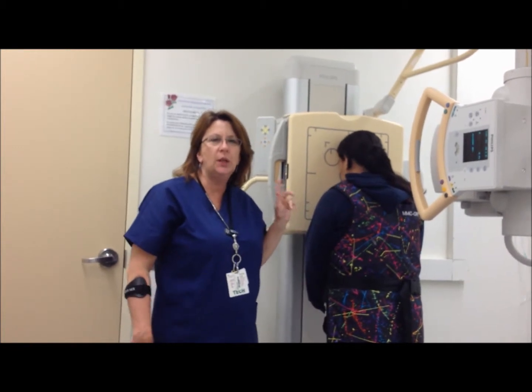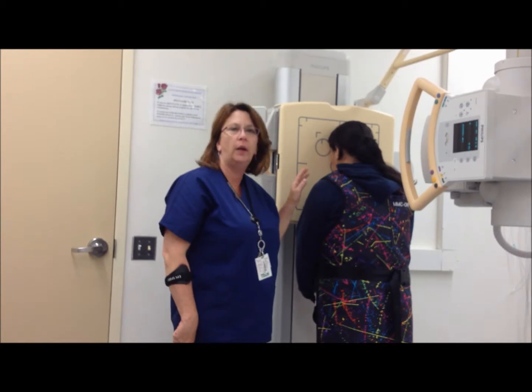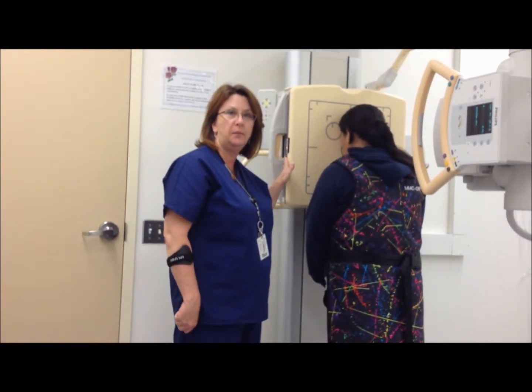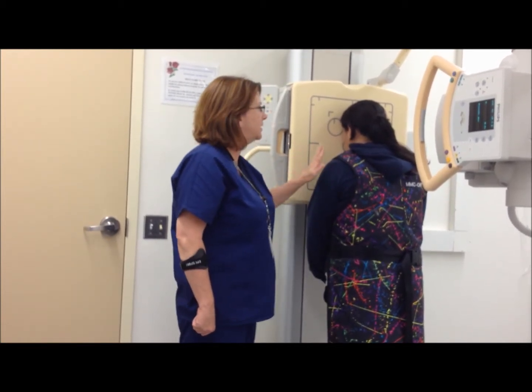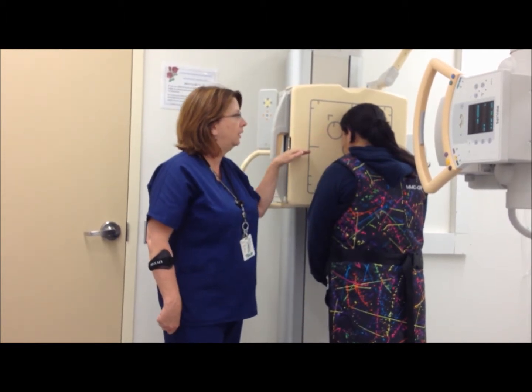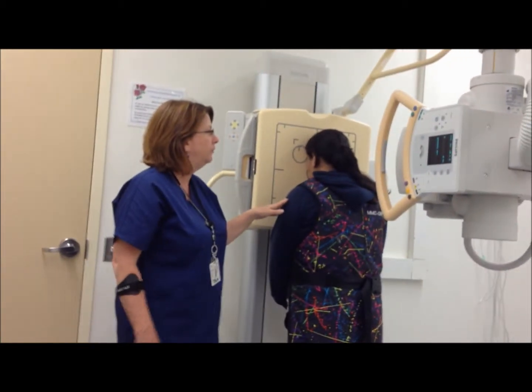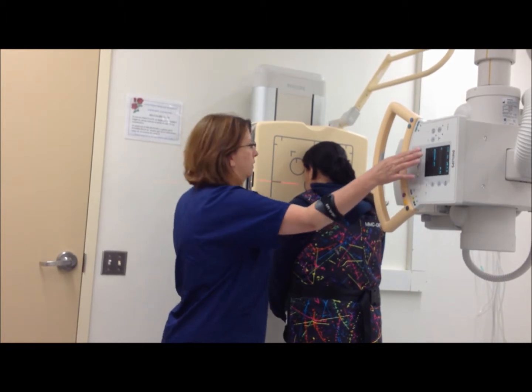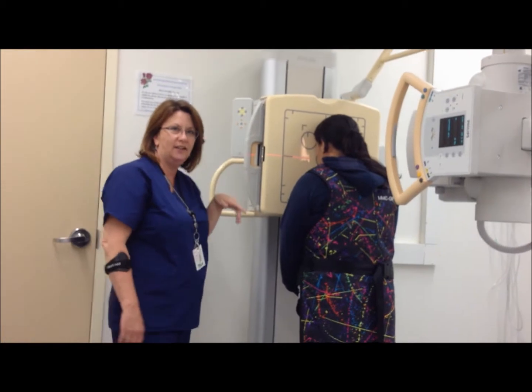Okay, for our mandible series, I'm going to be doing 4 images. My first one's going to be a PA mandibular rami. We'll be doing this on an 8x10 cassette landscape. My patient is positioned forehead and nose on the IR. Her OML is perpendicular to the IR. Her mid-sagittal plane is perpendicular. My CR is perpendicular. It'll enter back here and exit the acanthion.